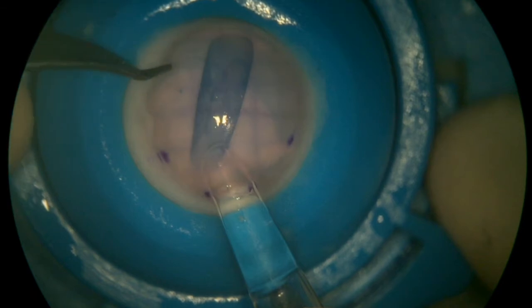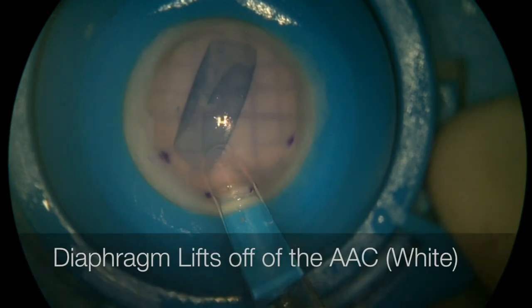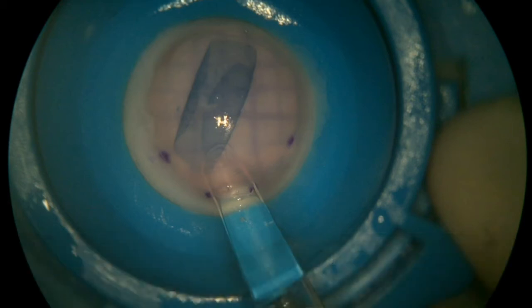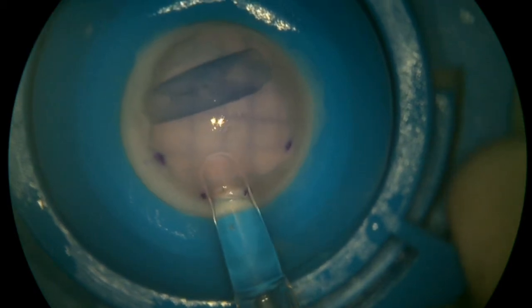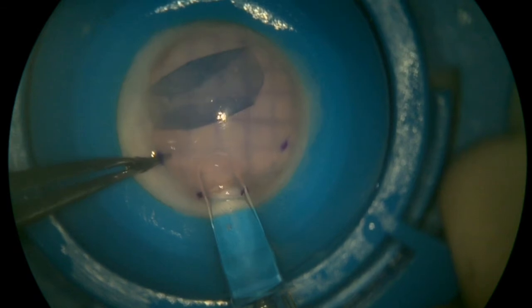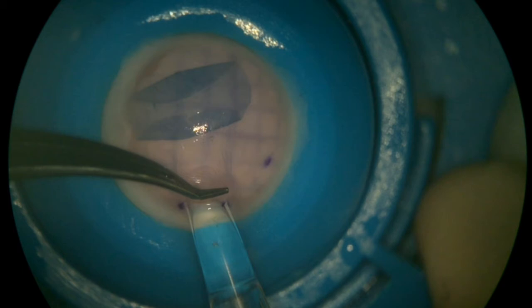When the paracentesis incision is burped, volume and pressure is released from the anterior chamber, which brings the latex diaphragm off of the artificial anterior chamber, making it white again. Further injection of fluid into the anterior chamber deepens the anterior chamber once more, and release of BSS from the anterior chamber shallows the anterior chamber again and lowers the pressure in preparation for removal of the injector.